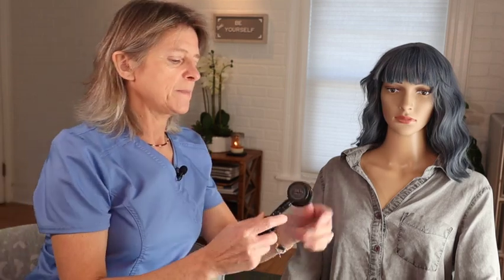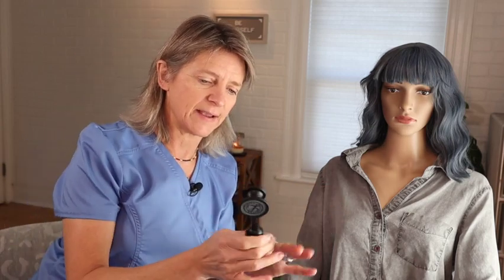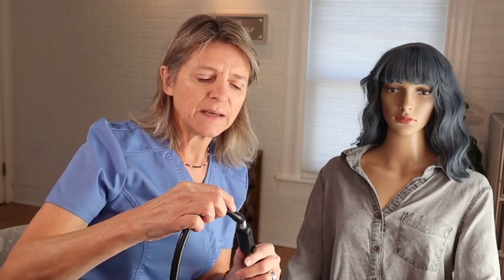All right, Jade, so I'm going to be listening to your lung sounds today. I have my stethoscope. Before I get into this, I wanted to talk about my stethoscope. Remember, I have this just the way it is without the tubing. I'm going to go ahead and put the tubing on. I don't need the tubing, but I want to use it because it makes it a little bit easier for me to move the stethoscope around.